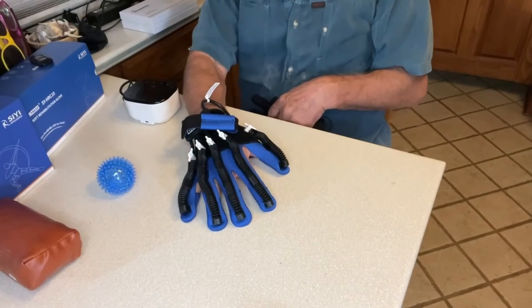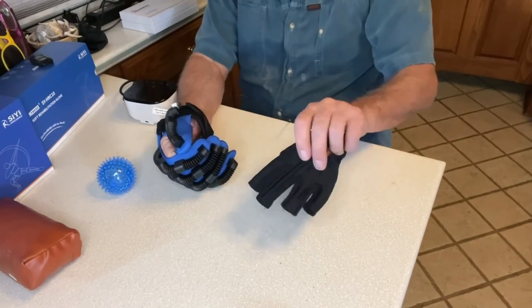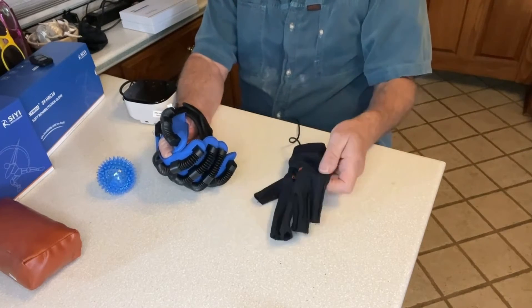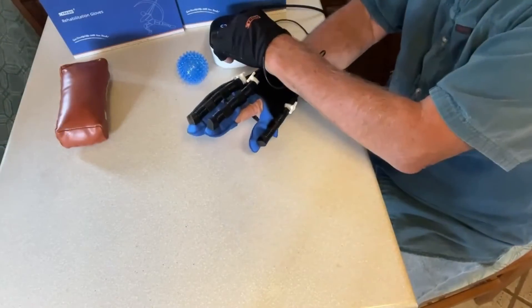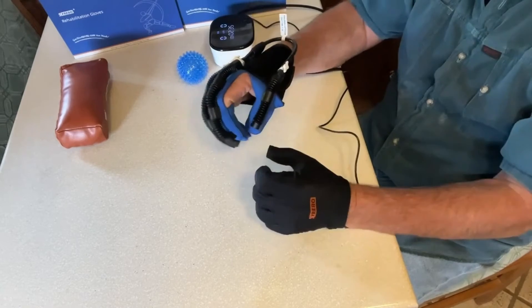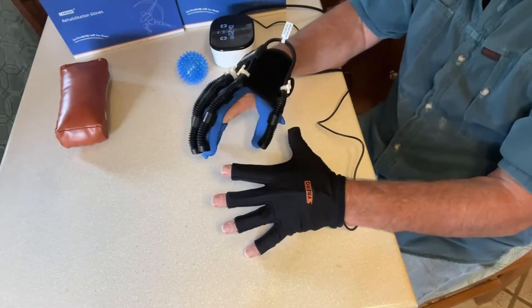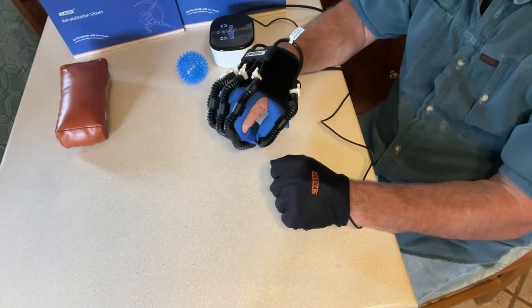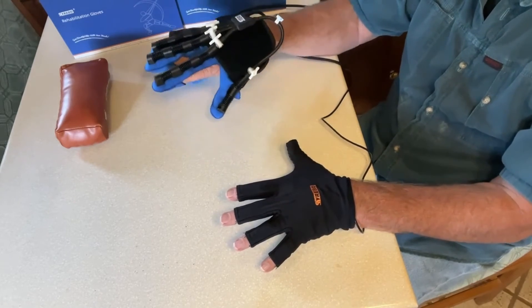That was passive training mode, and now we're going to try mirror mode — where this glove goes on the good hand and the other hand mirrors what you do. My hand clenched. Let's grab a ball.